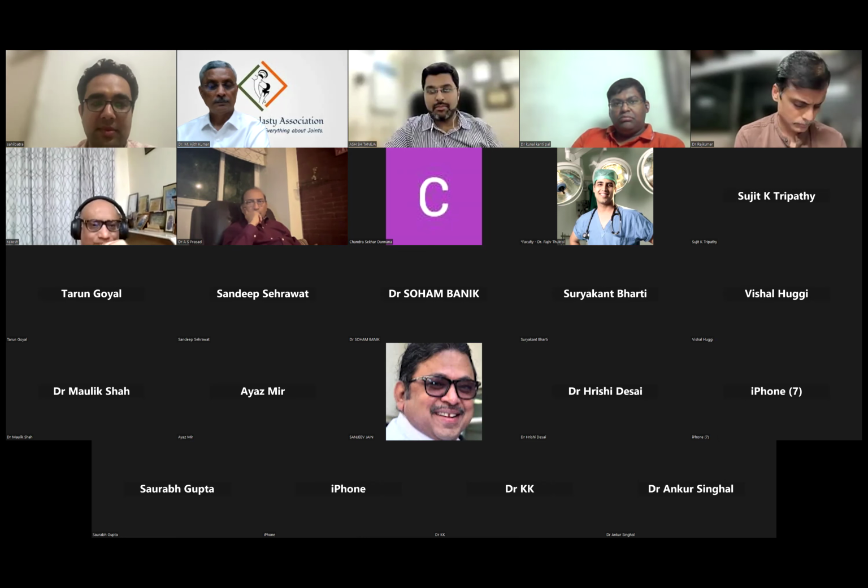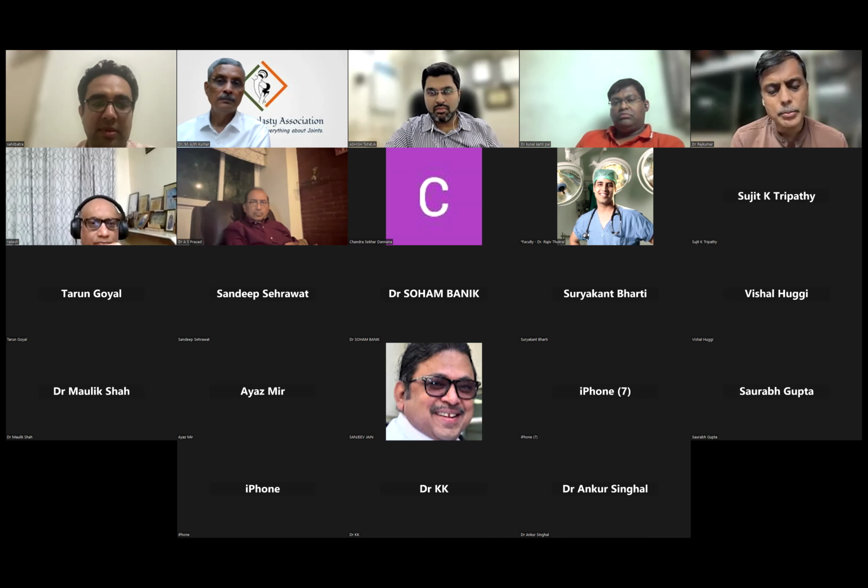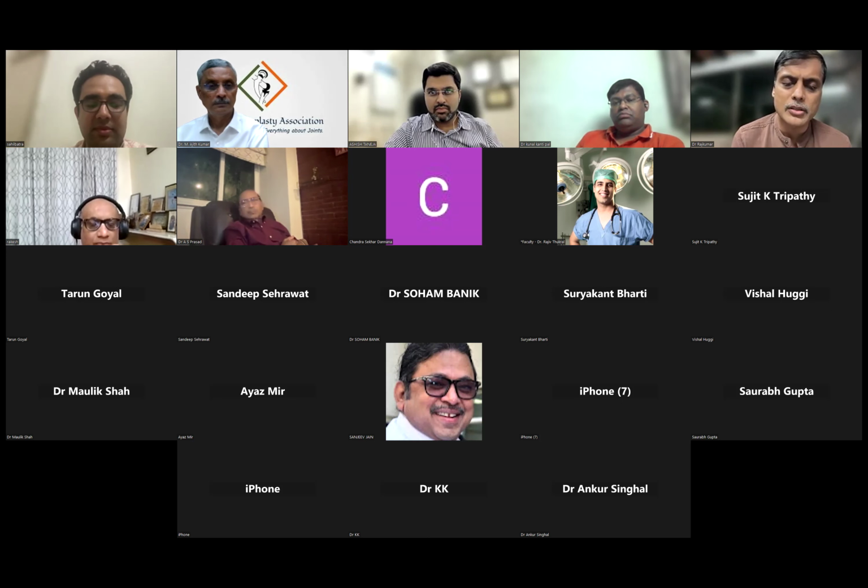I just want to ask, the limb preservation prosthesis, suppose for GCT, how long does it last, and suppose it gets loosened up, can we use APC in this case once the mega prosthesis is loosened up, or do we have to do something else with such massive bone loss? It all depends upon how much bone loss there is. The problem with the mega prosthesis is that the bone loss happens not only in the portion where the stem fixation happens. So how much bone loss, how much cortex is available, you have to do thorough planning, and decide what kind of further revision.